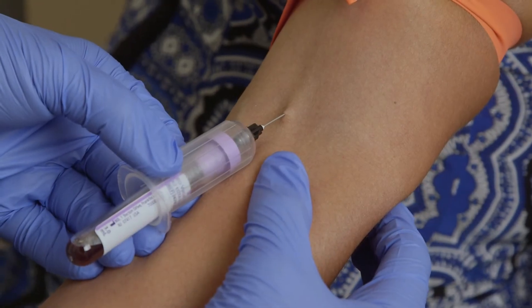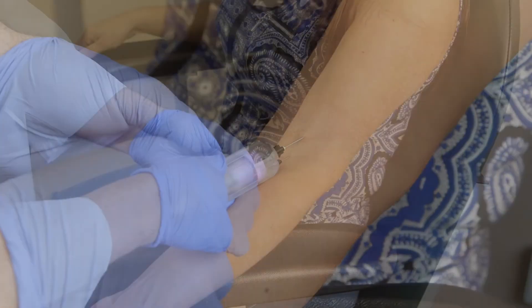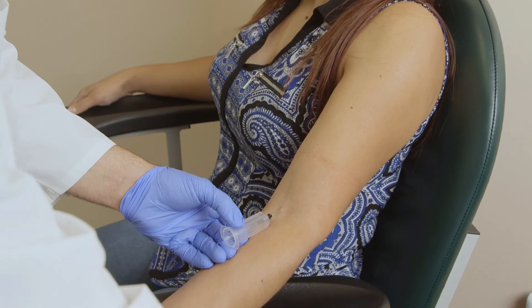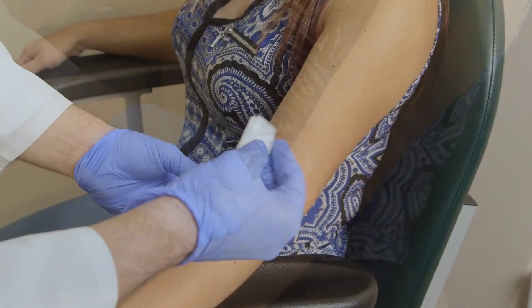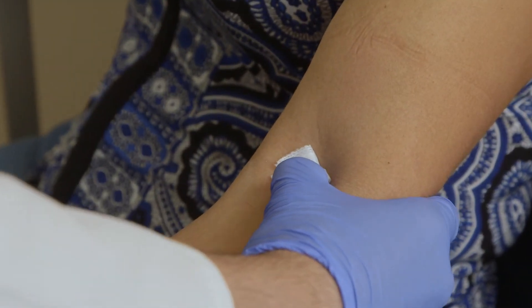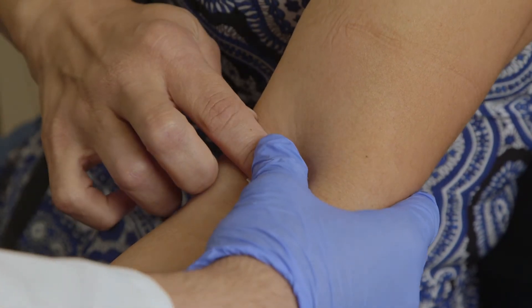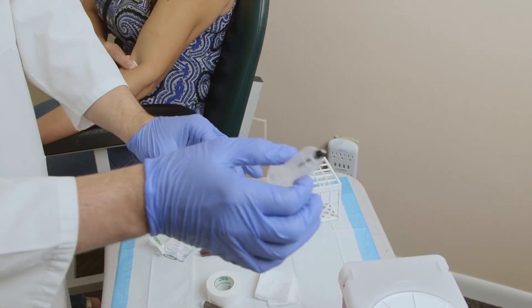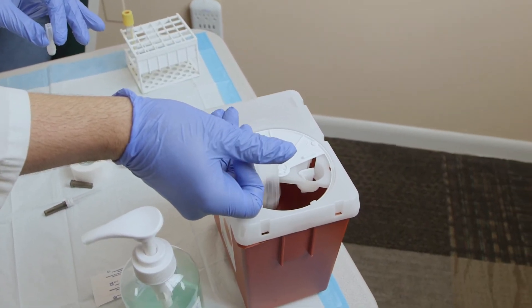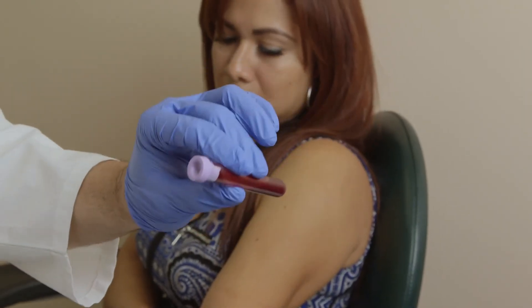When we are done with the multi-draw, first release the tourniquet. Remove the tube and invert two times. Put it down. Grab your gauze, fold once, fold twice. Take out the needle and ask the patient to hold pressure — can you please hold the gauze and put pressure on it? Never recap the needle. Always throw it directly into the sharps container. Grab the specimen tube and invert eight to ten times as required for this type of tube.